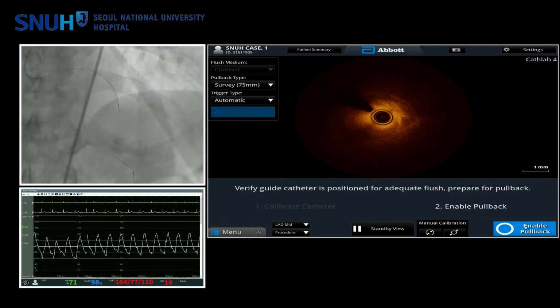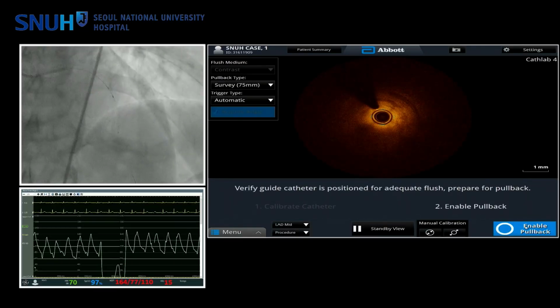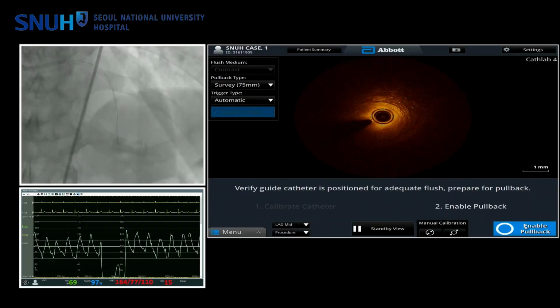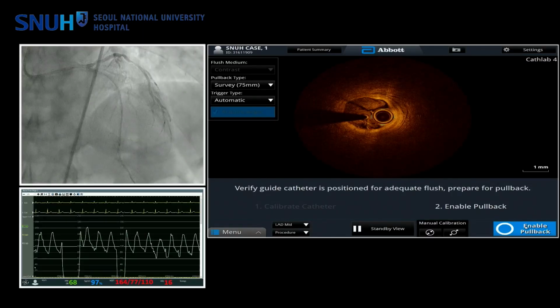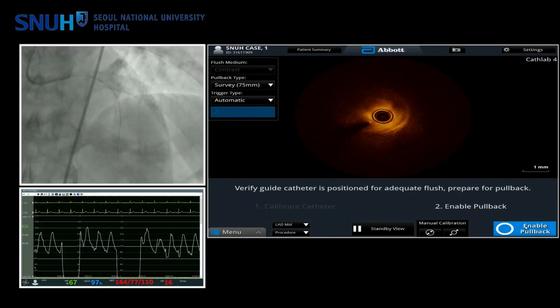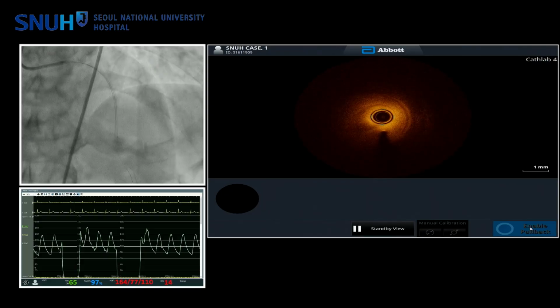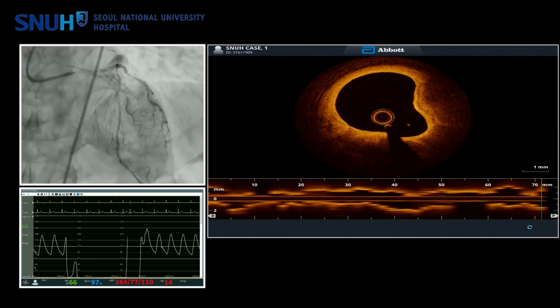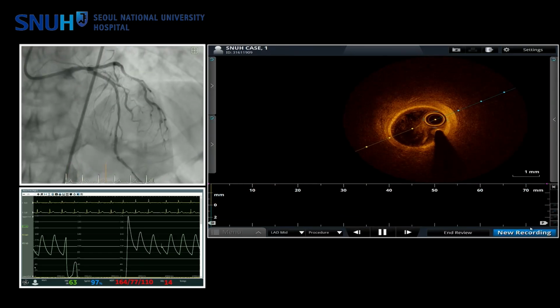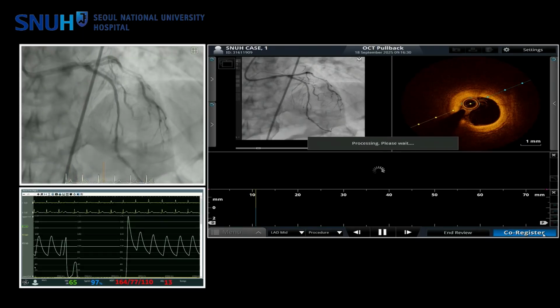As Dr. Kao mentioned, some segments require more shocks, whereas the remaining segments do not require such a high number of 20 shocks. We treated with different numbers of shocks depending on the characteristics and severity of calcium. I think also this is time sensitive, but anytime I see the soft portion of the wire, and that's where the distal tip of the IVL balloon is, I cringe a little. So I think just being a little bit cautious with that is important.